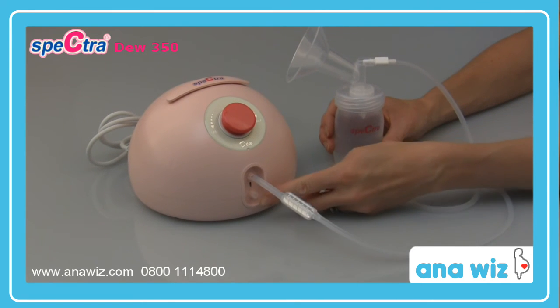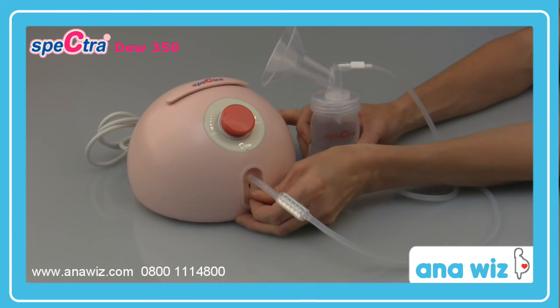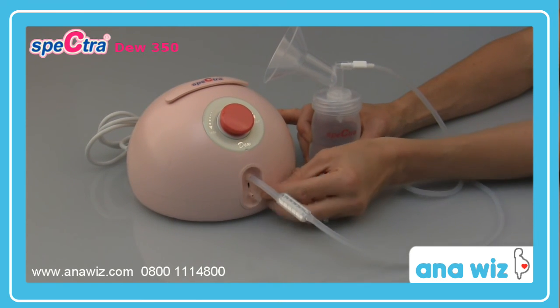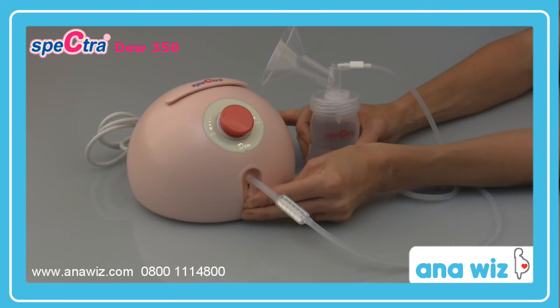Should you require to do double pumping, just remove the cover here and attach the second milk collection set to this hole.